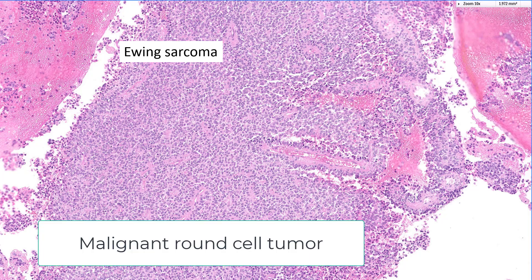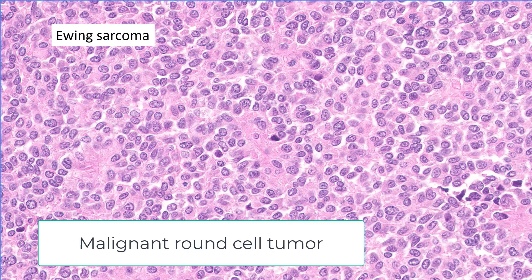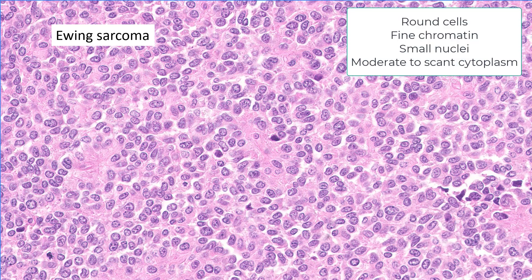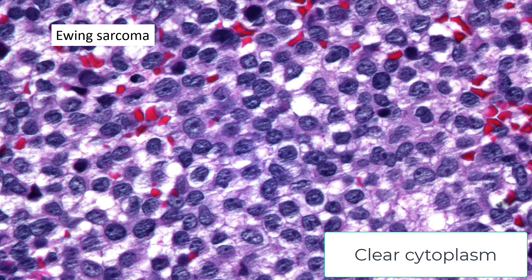This is a classic Ewing sarcoma — fundamentally a malignant round blue cell tumor with very monotonous nuclei and often some necrosis. It's a malignant round cell tumor with monotonous round to oval nuclei. Typically, you do not see prominent nucleoli. You'll see fine chromatin and a little bit of cytoplasm, which in this case is pale eosinophilic. That's classic, but there are variations on the theme.